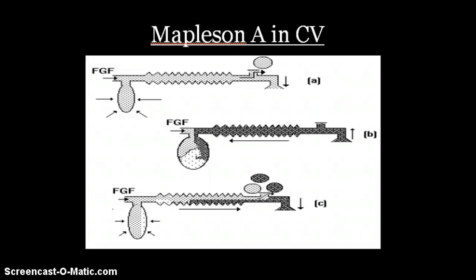During controlled ventilation, the expiratory valve must be partially closed to facilitate intermittent positive pressure ventilation. On inspiration, the patient is ventilated with fresh gas, and part of the fresh gas is vented through the valve once enough pressure has developed to open the valve. During expiration, the fresh gas from the machine flows into the reservoir bag, and all the expired dead space gas and alveolar gas flows back into the tubing until the system is full again.